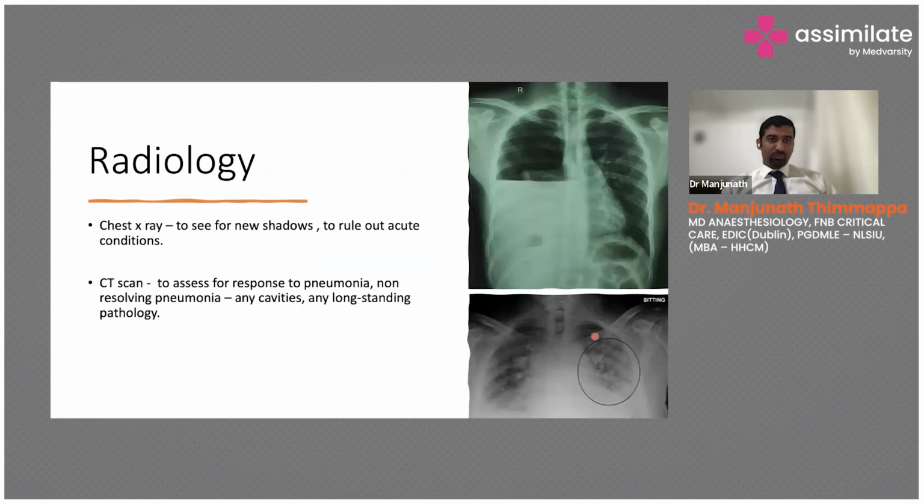So I know, and then comes radiology. All this I'm just touching upon for monitoring and assessment. On the chest X-ray, in the ICU, a chest X-ray is required, though we do an ultrasound for all the patients. If you have a patient with ventilator-associated pneumonia, to diagnose it you look for new shadows and use the VAP scoring system. So you might have to send cultures to diagnose VAP.